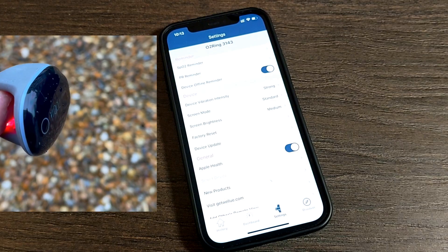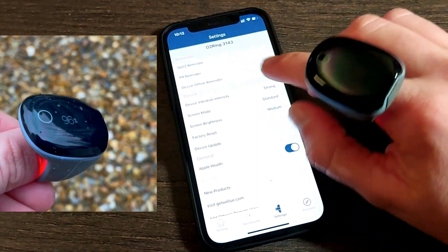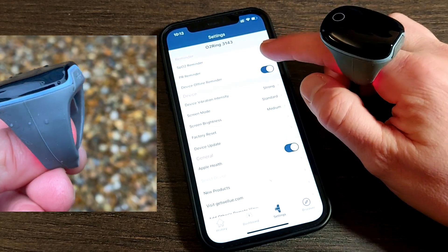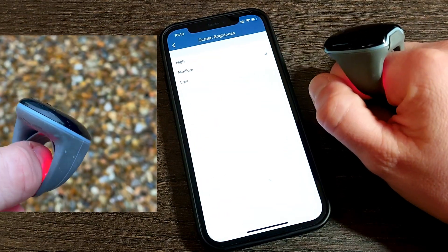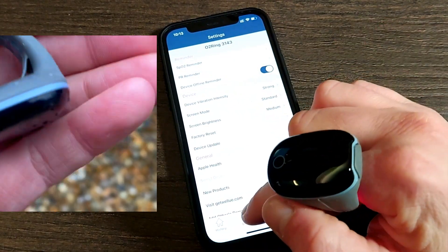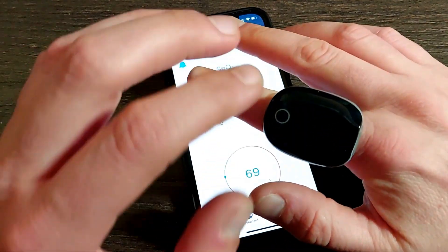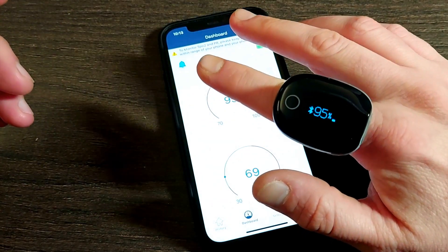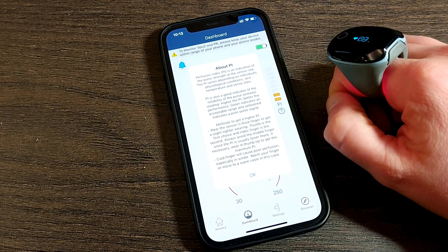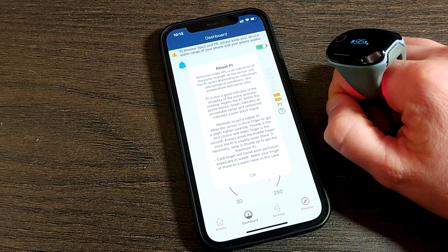You can also adjust the reminders, though I keep them at default values as they're informative in nature. Just below the reminders is the device settings section. Adjusting screen brightness to low or medium will prolong battery life compared to using the high setting. Let's jump to the dashboard screen — this is your spot reading at a point in time, showing your current SpO2 and pulse rate values while wearing the O2 Ring.